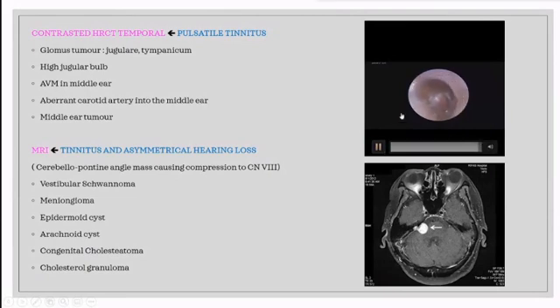So this is from endoscopy, but sometimes you should also be able to see this on otoscopy. When we perform otoscopic examination, we see that there's something pulsatile medial to the intact tympanic membrane. So the first thing you need to think of is that there might be a vascular tumor medial to the tympanic membrane. So don't try to poke the tympanic membrane, because if you try to manipulate the tympanic membrane or the middle ear, it will bleed.